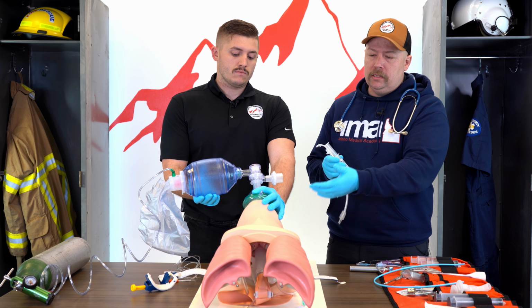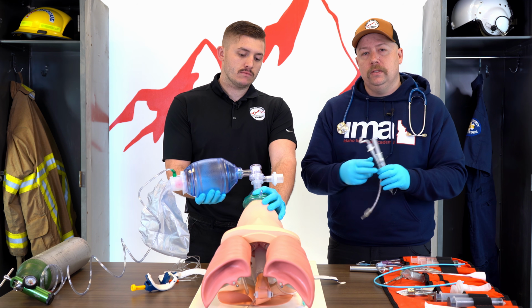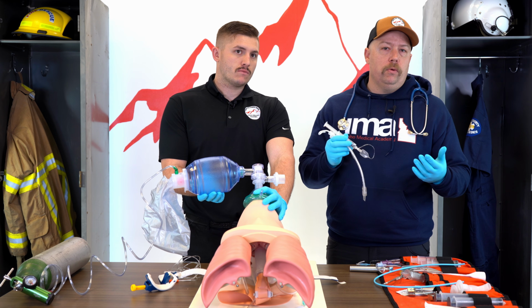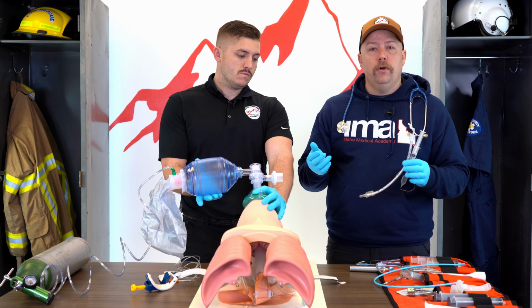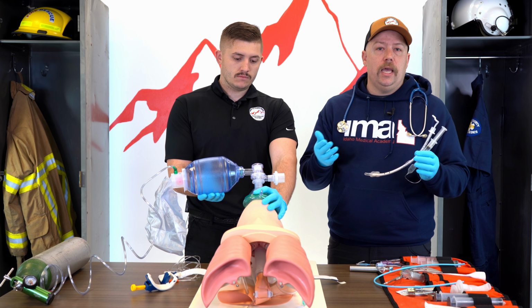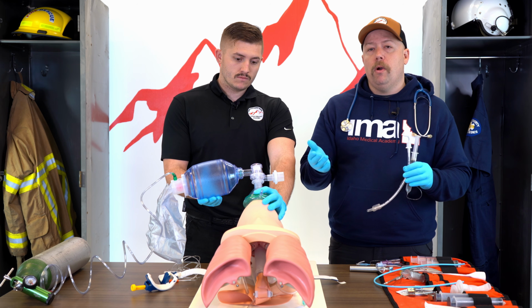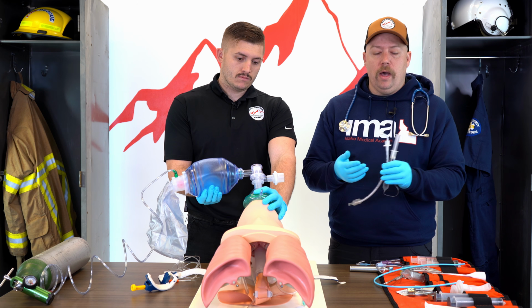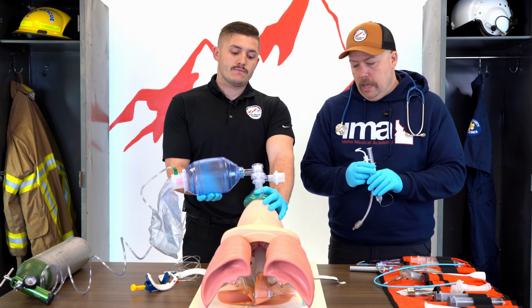The sizes are going to be based off the patient size. We're using a 6.0 because that's what we use for the mannequins. But 7.0, 7.5 is probably what we are typically going to go for. 7.5 or above is preferred by the hospital, because if it's a 7.0 or below, there are certain things they can't use that for. So they like a 7.5 or above. But just go off what your partner says if they have a special request as far as sizes go. Obviously, pediatrics are going to be much smaller. Adults are going to be bigger sizes.